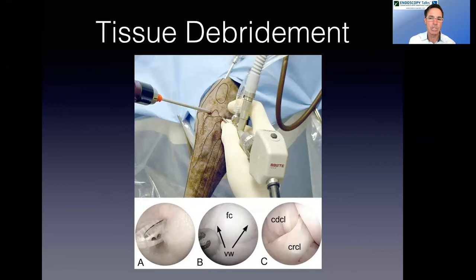On this image, you can see a fluid line coming in on our scope cannula. So it's delivering the fluid in alongside of the scope. The fluid circulates through the joint and will flush out blood and any debris, and it will exit the joint through that egress cannula.